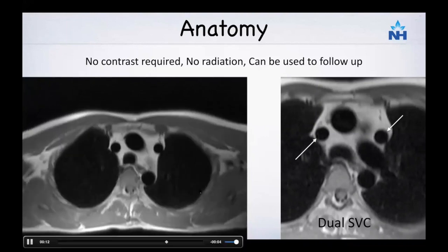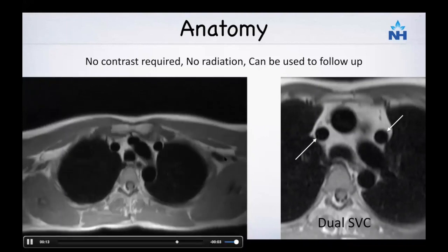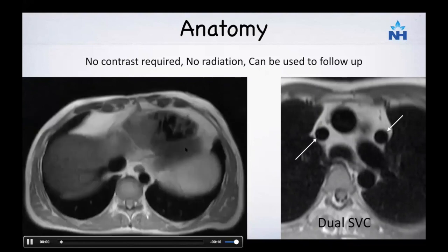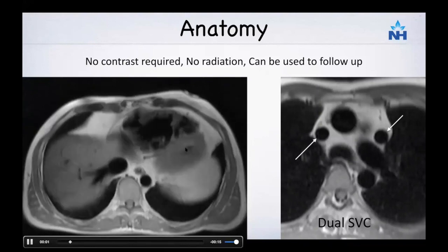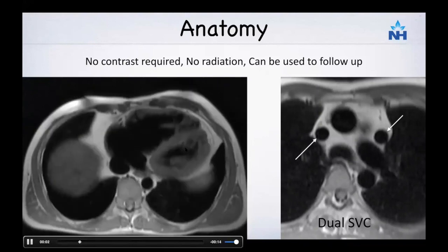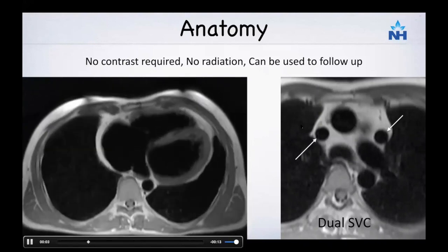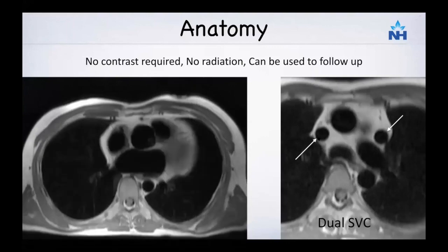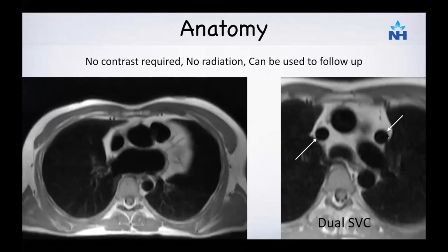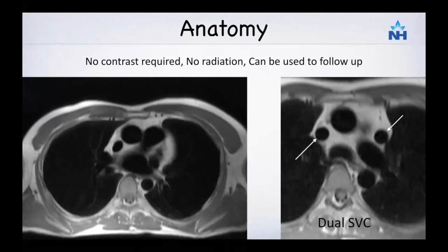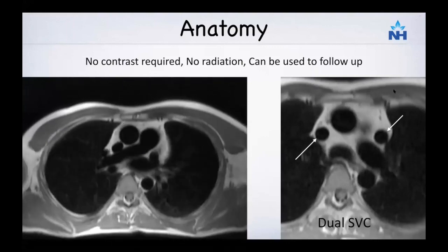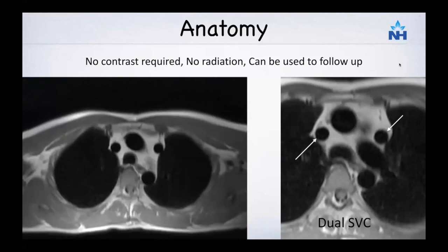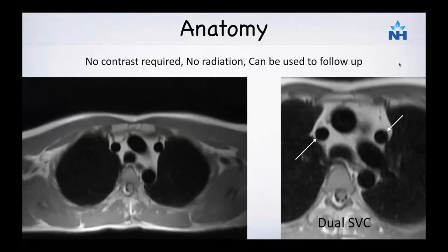For example, these images are of a patient who is breathing freely during the examination — you don't even have to hold your breath. And what we can see is an incidental right SVC and a left SVC, which may or may not have any clinical significance.